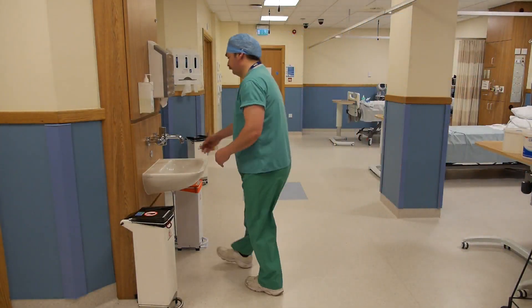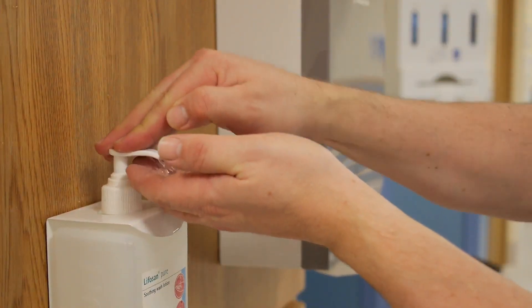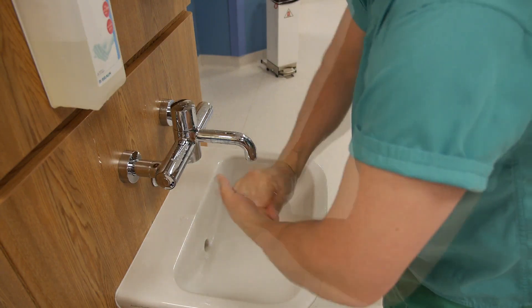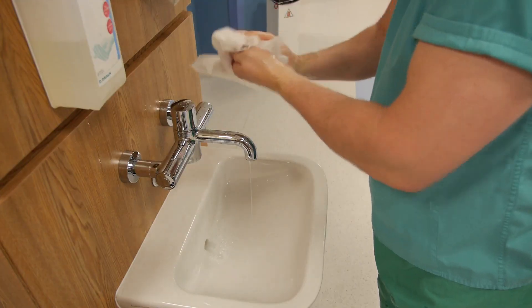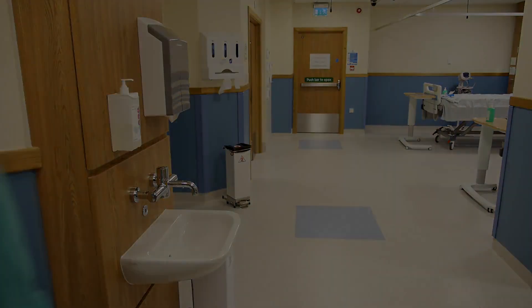Hand washing is a key aspect of infection prevention and control. Wet hands and apply enough soap to create a lather. Rub the soap into all areas of the hands, thumbs and wrists. Dry your hands thoroughly using paper towels and dispose into a foot operated waste bin.